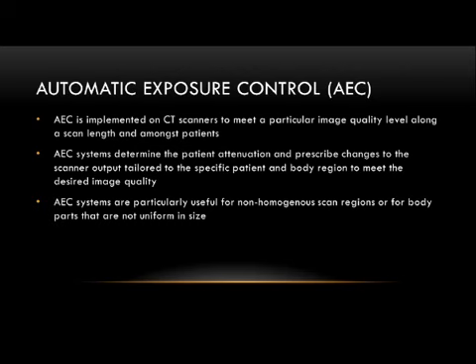They're hopefully a fairly comprehensive set of slides that go over a lot of the different acquisition parameters and things like iterative reconstruction and how they affect dose. And so some of the slides I'm going to use in here talking about tube current modulation are actually pulled from those as well, and those are labeled right at the bottom. So you'll be aware of those. But they're an excellent resource for you to refer back to, to share with the technologists at your institution, with radiology residents, with staff radiologists. Useful information.